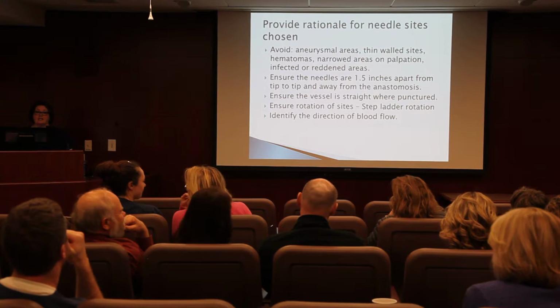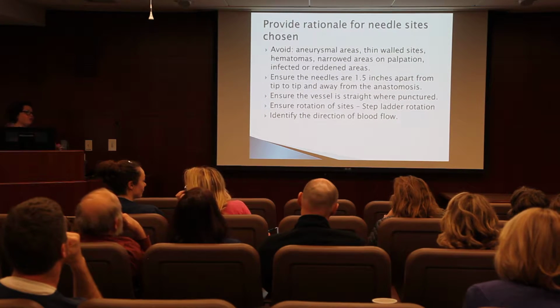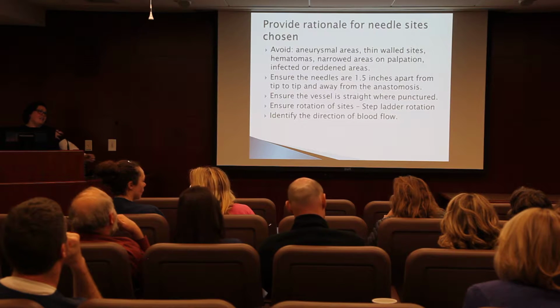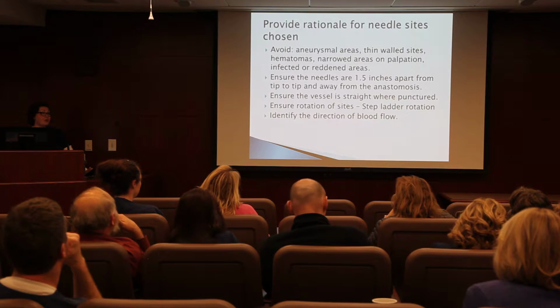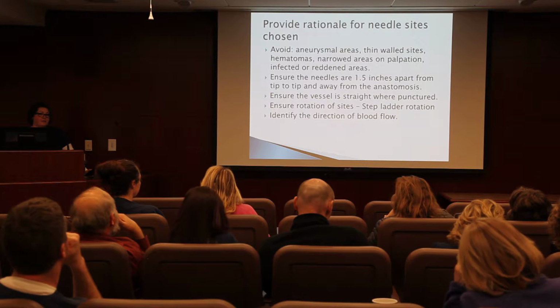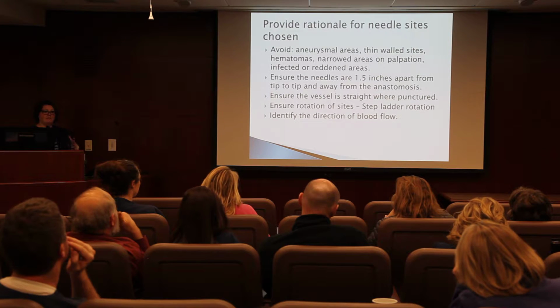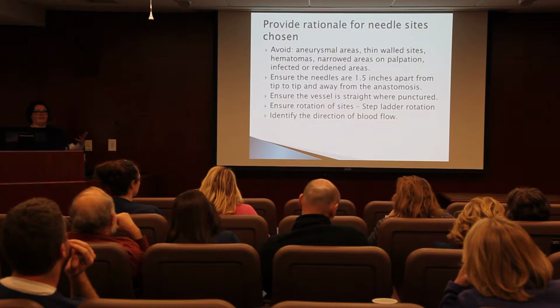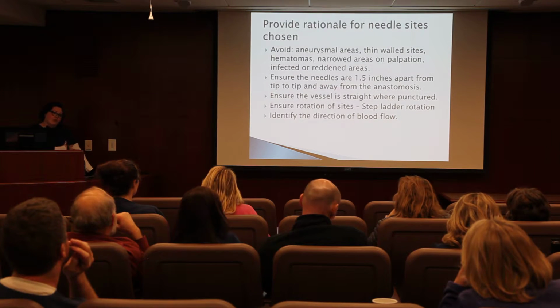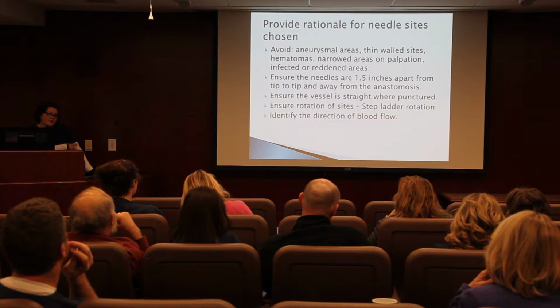Needle sites. You want to avoid the aneurysmal areas, and I know everybody wants to go for that because that's what they see. And the reason why those big areas are there is because that's where everybody is sticking. When you're not used to accessing a fistula, it's the easiest spot to go. Put the needle in, you could probably do it blindfolded, but we really would like you to avoid those areas if you can.